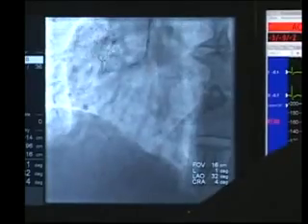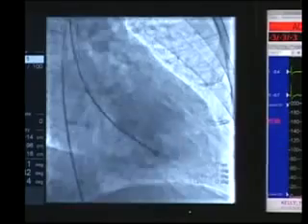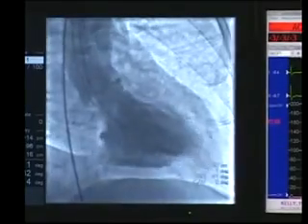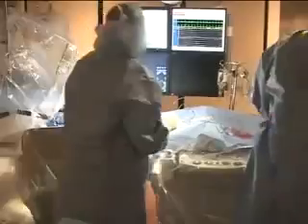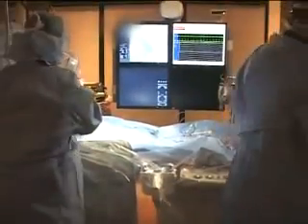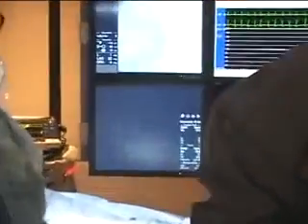The right coronary artery is totally occluded, and he's been having symptoms intermittently for the last couple of days. So we're going to open up the right coronary artery. It looks like there's been a little bit of damage to the bottom part of the heart, which is the part supplied by the right coronary artery. This is likely a recent occlusion — his last prolonged episode of chest discomfort was today. He has damage to the inferior bottom wall of the heart, suggesting he is in the process of having a myocardial infarction, or heart attack. The left system looks fine.